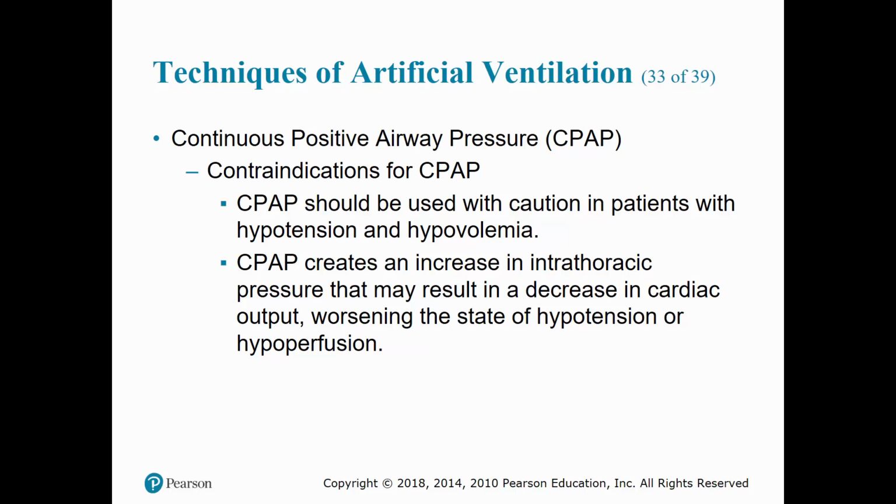Also, any patient with a pneumothorax or trauma to the chest, especially one with penetrating trauma, does not get CPAP. Any patients with a tracheostomy or a condition where increased intrathoracic pressure causing hypotension would be a concern should not get CPAP.